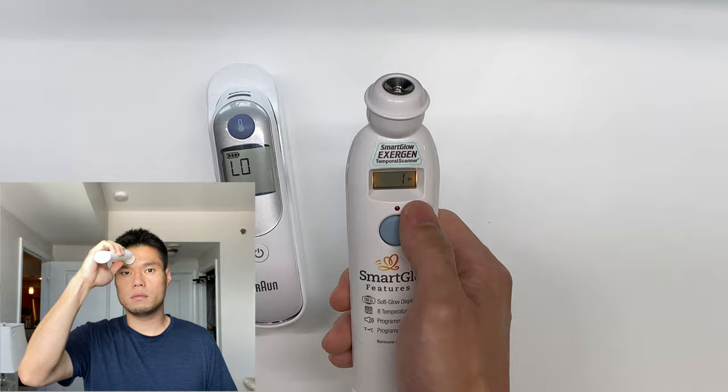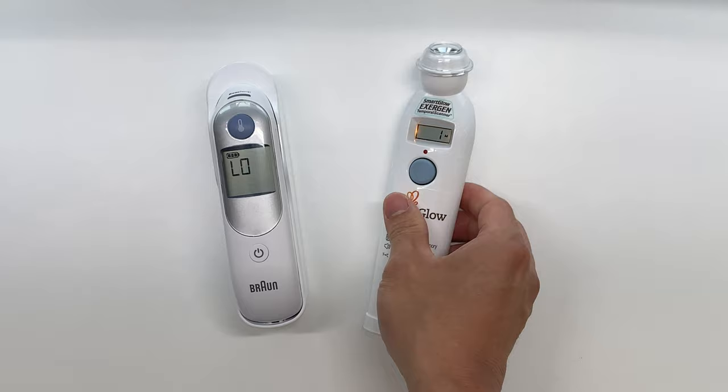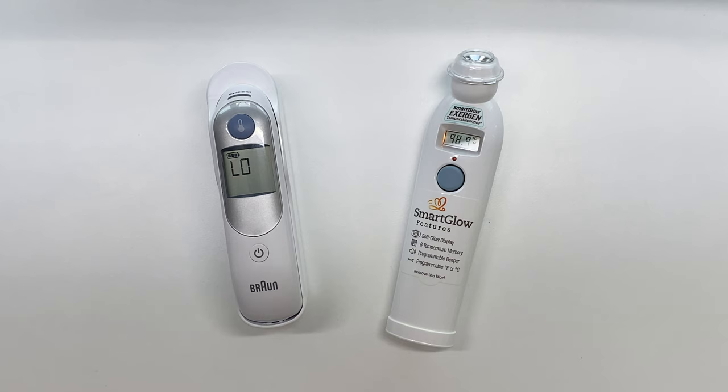Now one thing to note is the Braun consistently gave me temperature readings a degree or half a degree higher. In the manual it does note that the temperature readings are slightly higher because this one is closer to an internal organ, as opposed to the Exergen which is measuring it on the surface level.